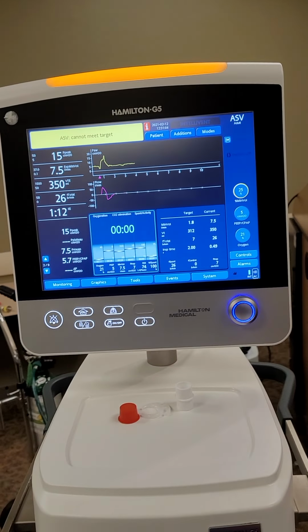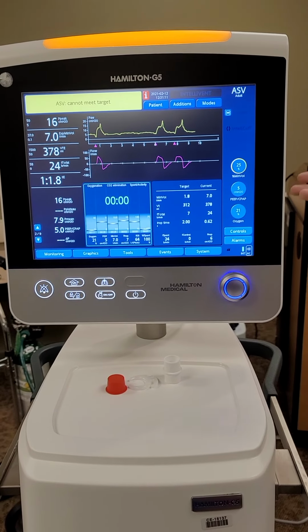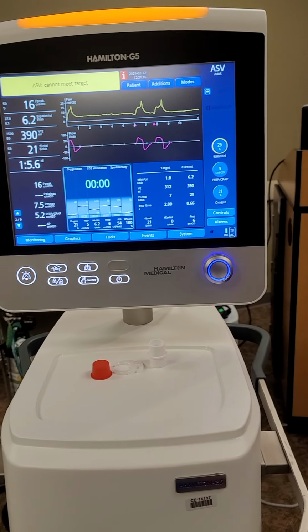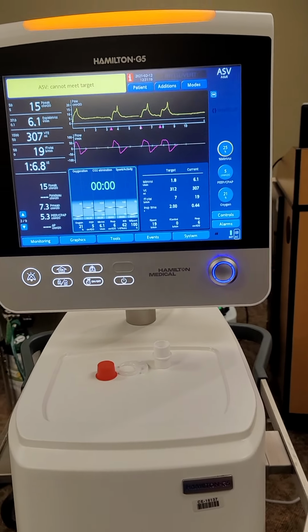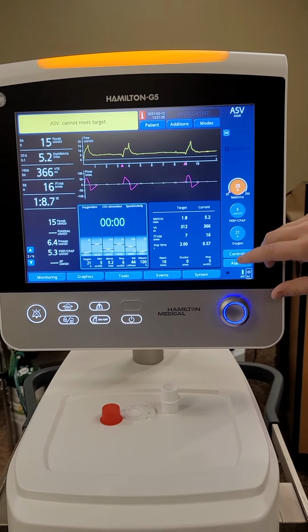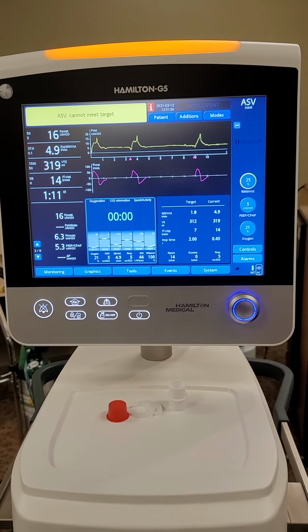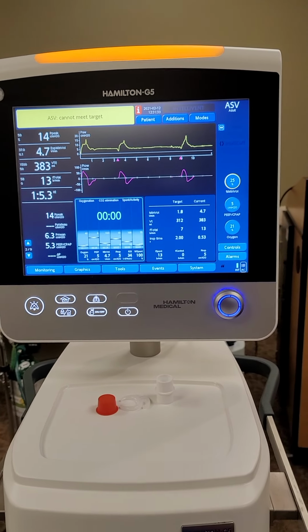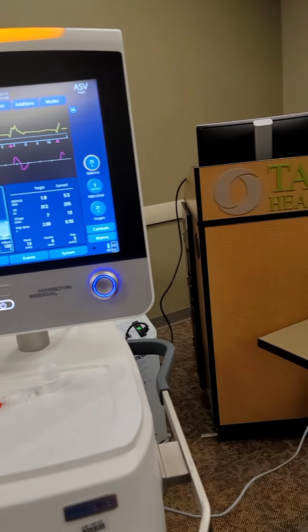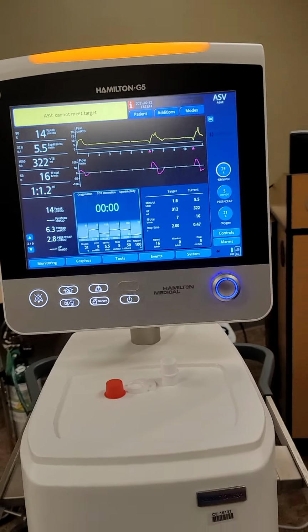Remember, all this is doing is the ventilation part. So my PEEP can be 30 here. Your PEEP can be whatever it's going to be in pressure control and ASV. Oxygenation is still going to be separate. The ASV part is basically just ventilation. It's just ventilation. Wow, I didn't know that. Okay. But instead of having a rate, tidal volume, and I-time, you have one knob that you dial up and down for CO2 control. So basically, you increase your percent minute volume to whatever your previous minute volume was. Okay, that's it. If I was starting somebody in ASV, I'd start around 100 to 110%. Okay. That's usually what I do.